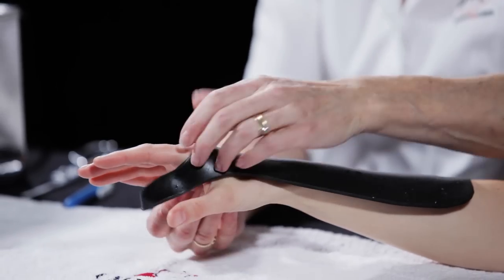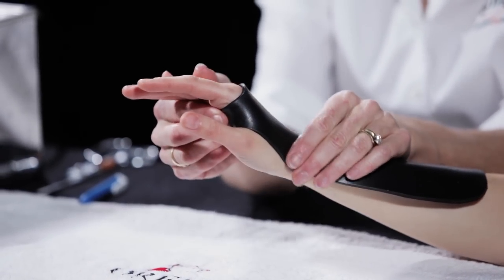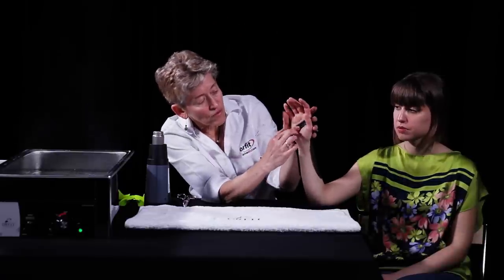Stretch the tiny tab into the first web space, making sure it's proximal to the distal palmar crease.